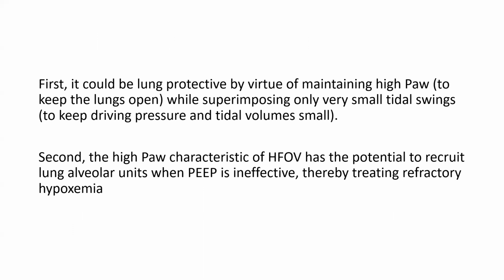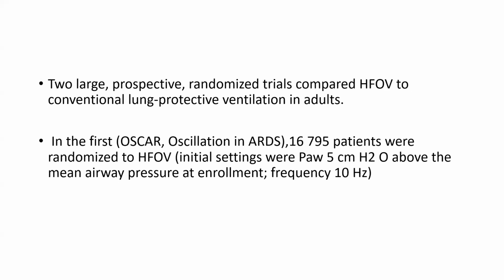First, it could be lung protective by virtue of maintaining high airway pressure while superimposing only a very small tidal volume. Second, the high airway pressure characteristic of high frequency oscillatory ventilation has the potential to recruit lung alveolar units when PEEP is ineffective, thereby treating refractory hypoxemia.